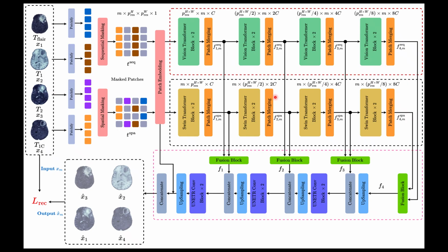The spatial branch uses a Swin transformer with relative position embeddings. Here the job is different. You are modeling the local texture and anatomy within a single modality image. Swin's shifted window attention is computationally efficient for this because local spatial features are hierarchical, edges at fine scale, structures at coarse scale. Relative position embeddings also make more sense here because what matters is things that are relative to each other, not their absolute position in the image grid.